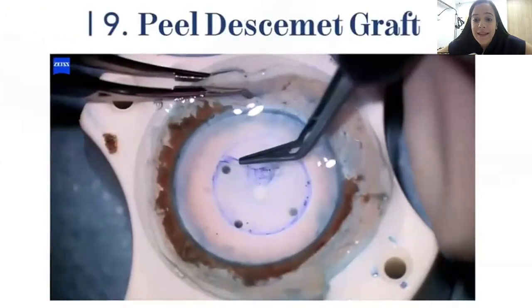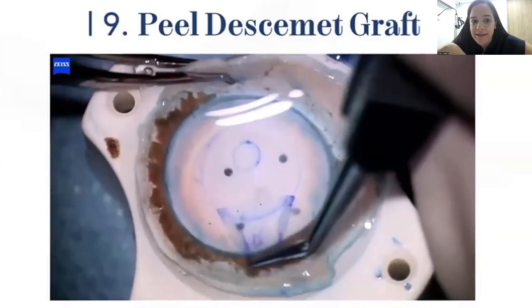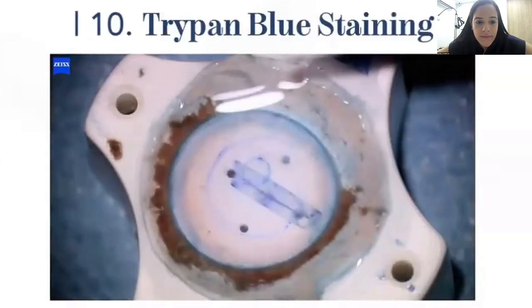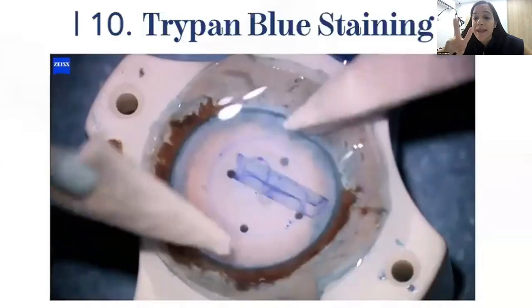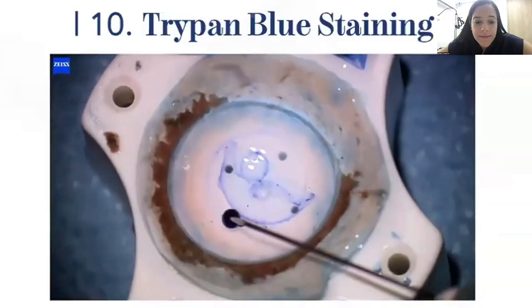Now we grasp the graft from a loose edge and peel completely. Everything is under BSS. Now we'll remove the BSS with a Weck-Cel and we will fill with trypan blue for 2 minutes to stain our graft. So when we insert it in the eye, we can see.